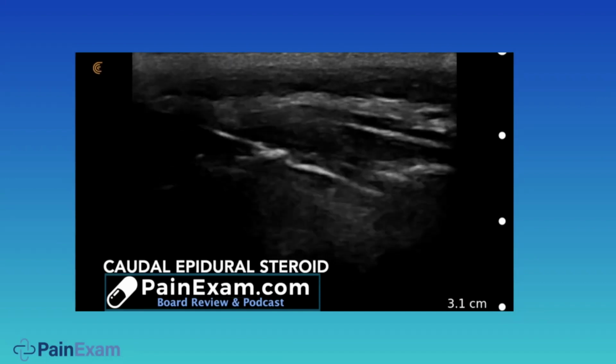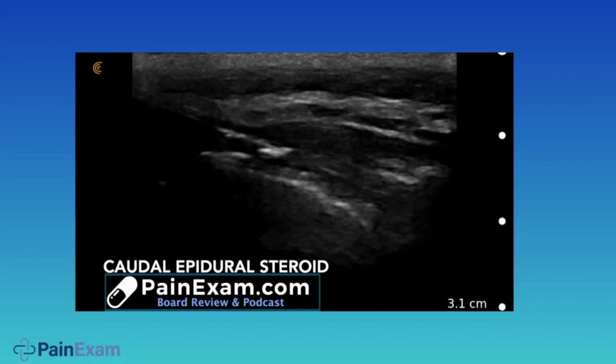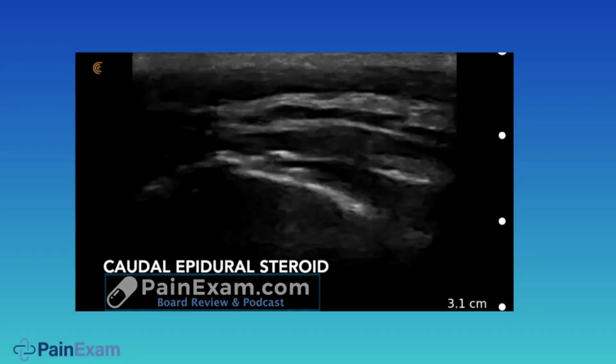That's what you see with a C-arm also when you do these cases with contrast. I do this in the office these days. I've been doing this for a while. I typically prefer fluoroscopy, but I think this is just as safe. It may not be just as accurate in terms of knowing where your medication spread. However, this is a procedure where I gave 40 milligrams of Depo-Medrol or Kenalog or methylprednisolone and 9 mLs of saline. So you get up to the lower lumbar levels. Minimal risk. Patients do great.